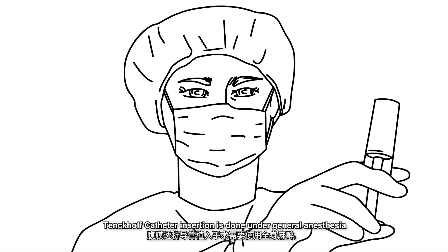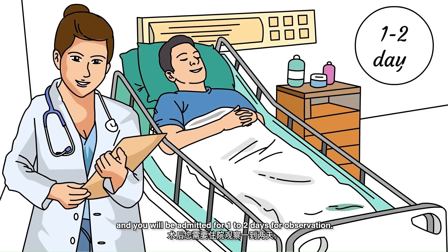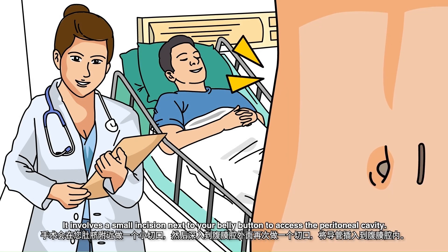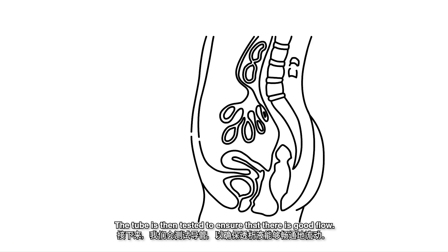Tenckhoff catheter insertion is done under general anesthesia and you will be admitted for one to two days for observation. It involves a small incision next to your belly button to access the peritoneal cavity. The tube is then tested to ensure that there is good flow.